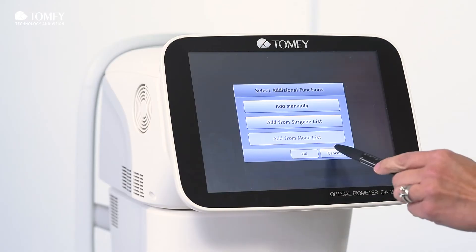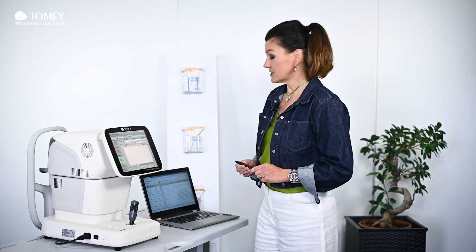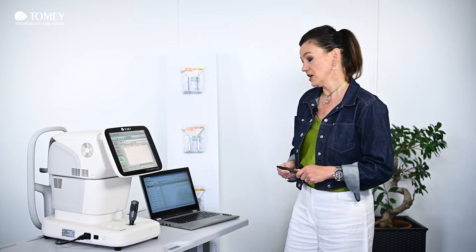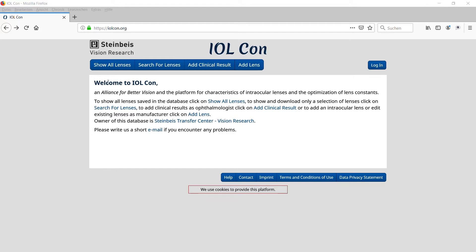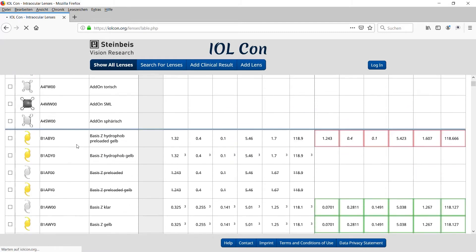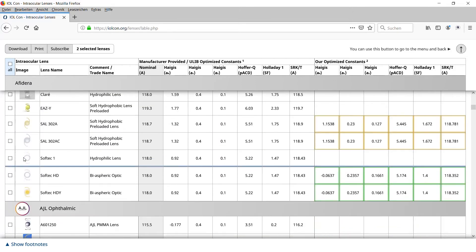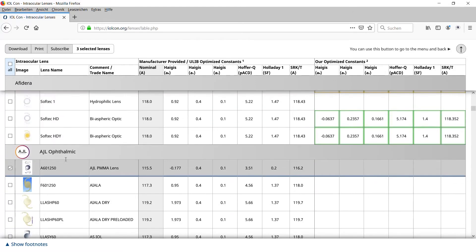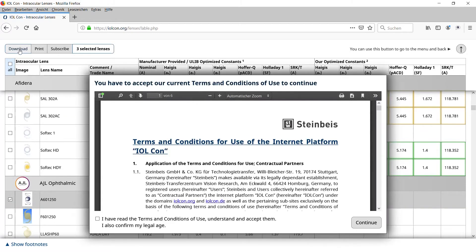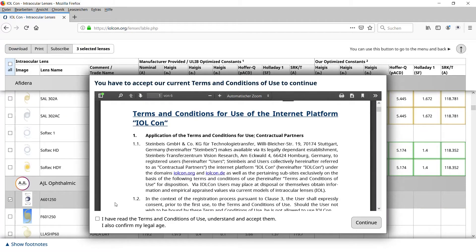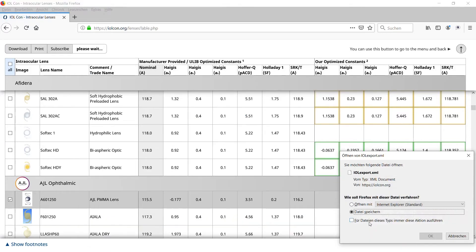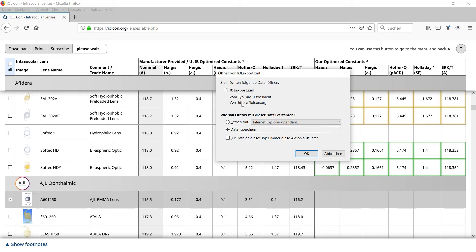Or you go to the website iolcon.org, where you can download your preferred models, which we will show you now. On the website you have an overview of more or less the most common manufacturers listed. You select your preferred model manually and then click on the download button, using a simple USB stick to download your preferred model.